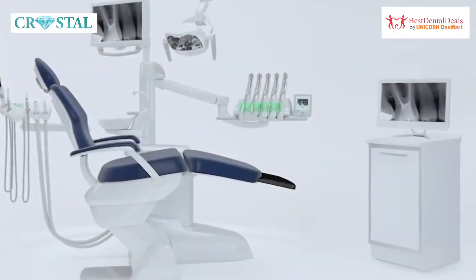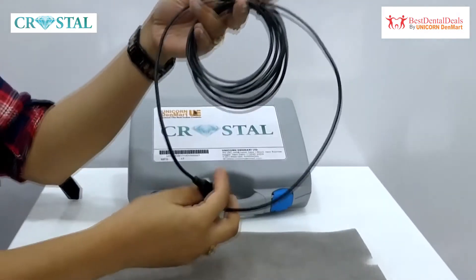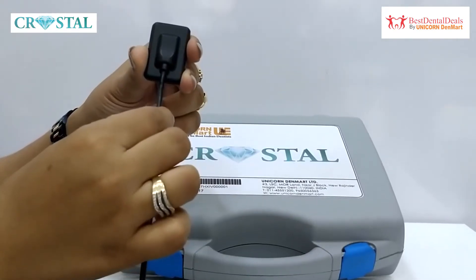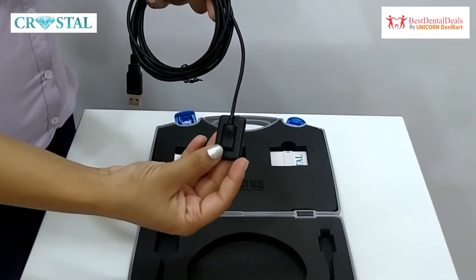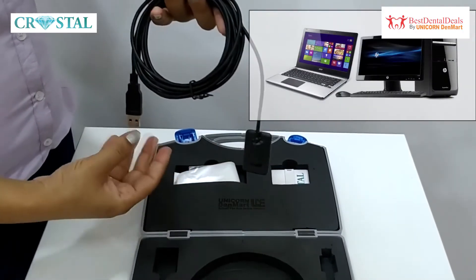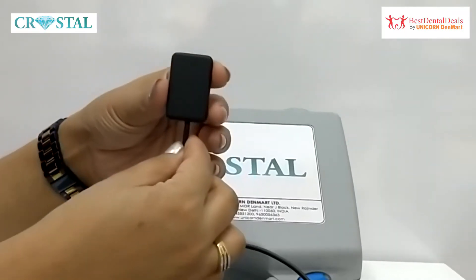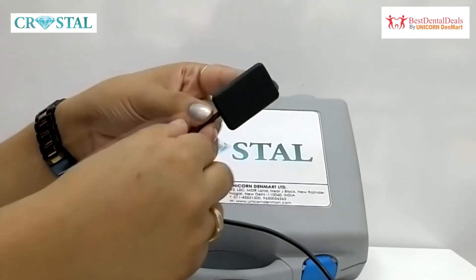The technologically advanced Crystal RVG has a sensor attached to a 3-metre long, high-quality, flexible cable which is secure and does not get easily detached from the sensor. The sensor can be connected to your laptop or desktop through the USB port at the end of the cable. The dimensions of the sensor are 36mm in length and 26mm in width.